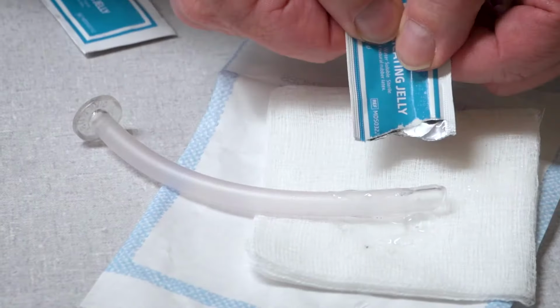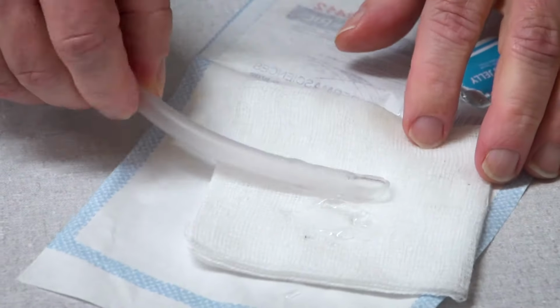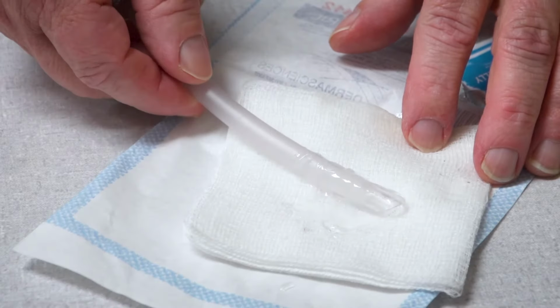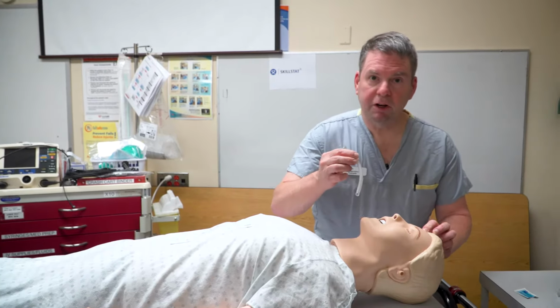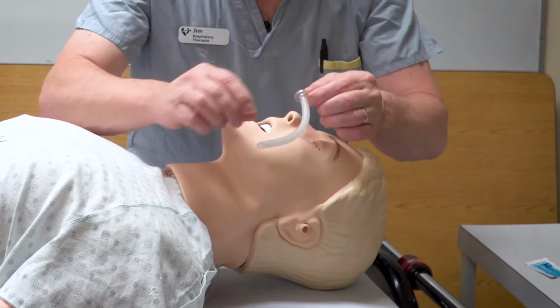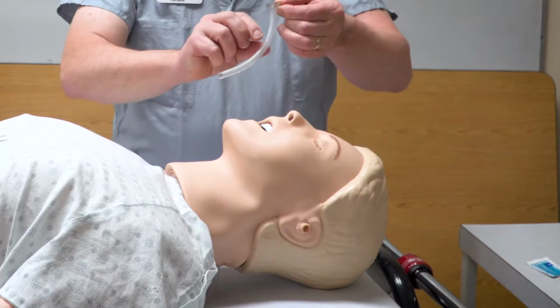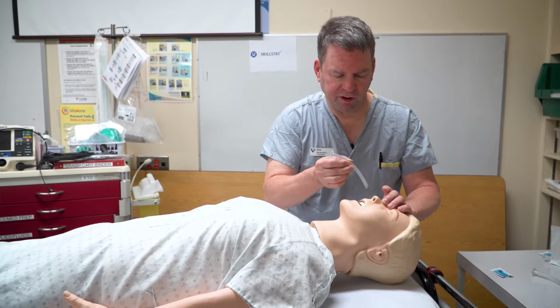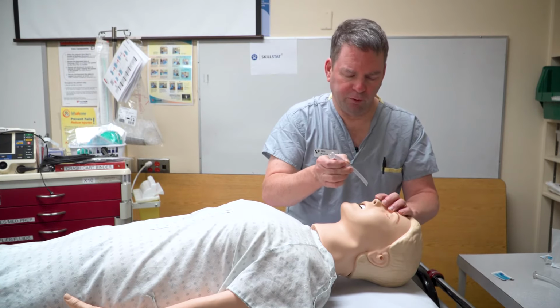The lubricant would go onto the sterile 4x4. And then you would just take the nasopharyngeal airway and just spin it on there to get the lube to go all the way around. And then the measurement of the nasopharyngeal airway is from the nares itself to the bottom of the ear. So if you laid that across there, that would make that one the correct size. And then the other component is you have to look at what size the nares are that it's going in. You want to use the largest one possible for the size of the nares.